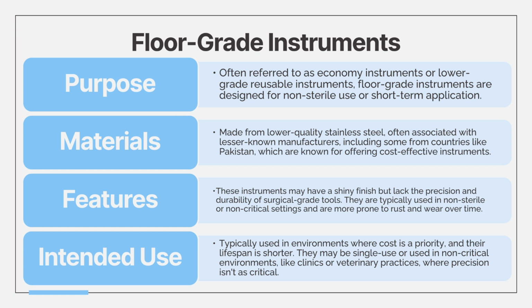And of course, I mentioned the leaching effect last class, I believe, and it basically just means the mixing of two very different metals, which can cause hazardous effects on instruments, which of course will put a risk on patient safety.